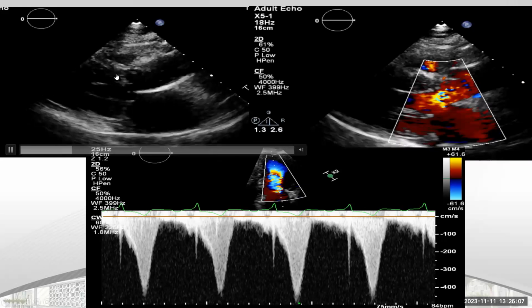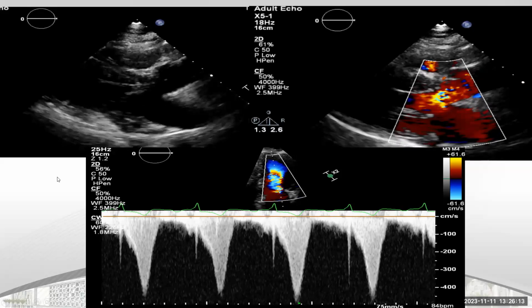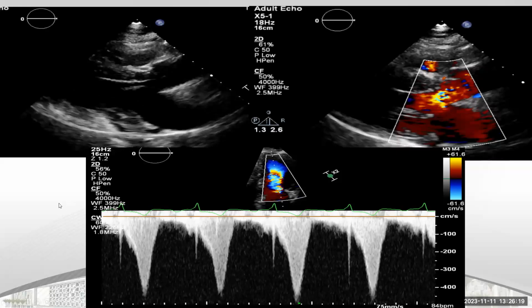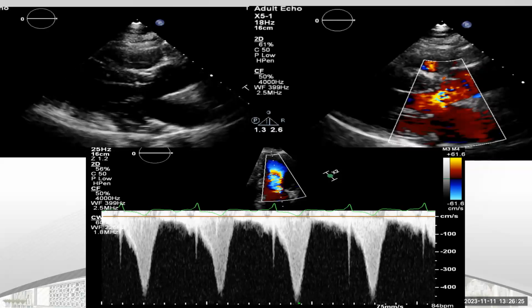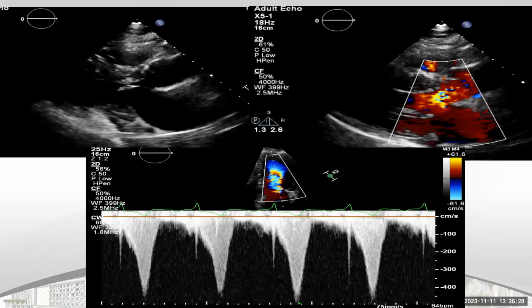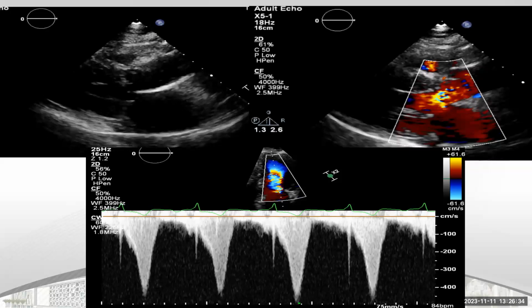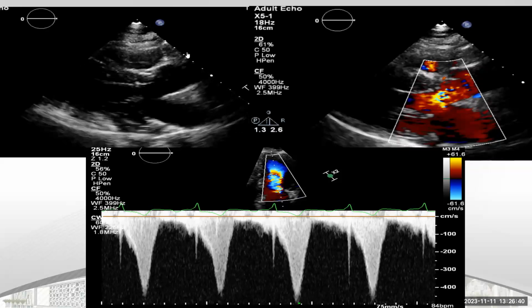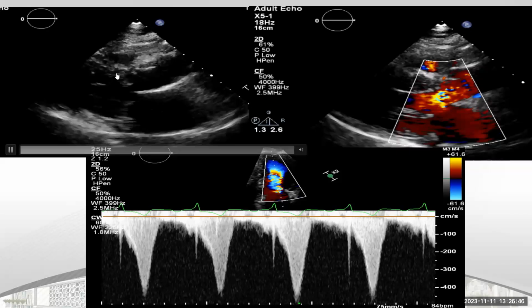And you may reach that there is some thickness in the LVOT. So if you want to pick up something, this is hypertrophic obstructive cardiomyopathy. This is obstructive, okay? Nice. However, sometimes they may bring you a muscular ridge or a subaortic membrane, and it is in the coding sheet as well. So you have to notice not every LVOT obstruction means this is HOCM. You have to see the thickness of the LV wall, especially the septum. However, in the exam, they will bring you very clear cases of HOCM, not like this. This is just very mild LV wall thickness, and sometimes we see this in HOCM.